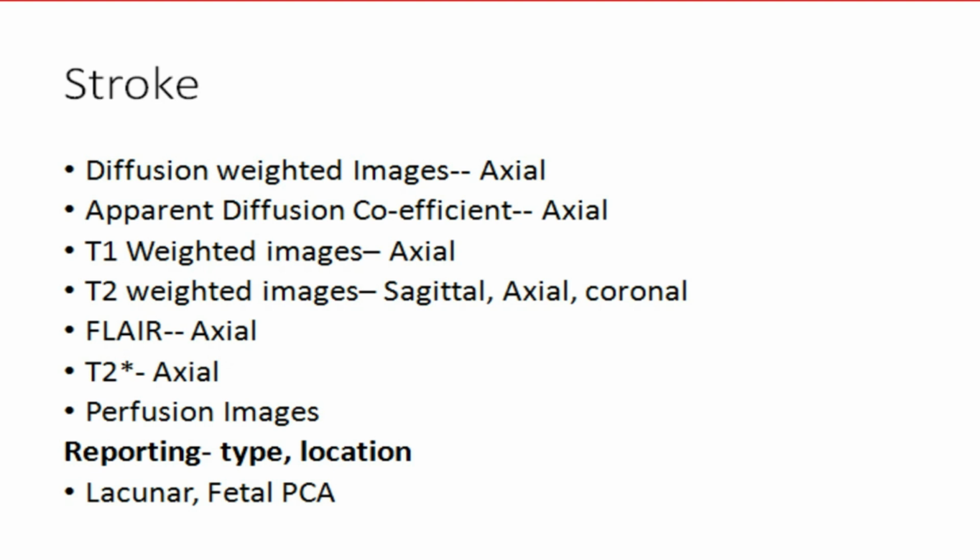So this is one thing which will give you some idea. The T2 weighted images should be done in all three sections. Okay? And we discussed the perfusion scan. It has happened with me many times that I see a report and the radiologist says there is a stroke. Okay? And personally, I don't see ADC and diffusion weighted images.